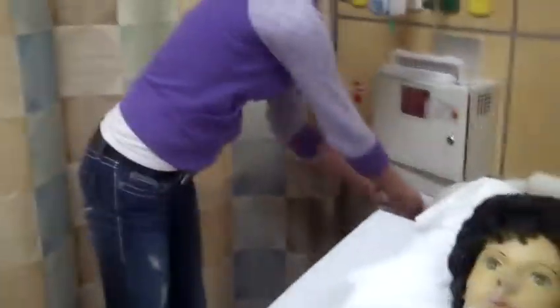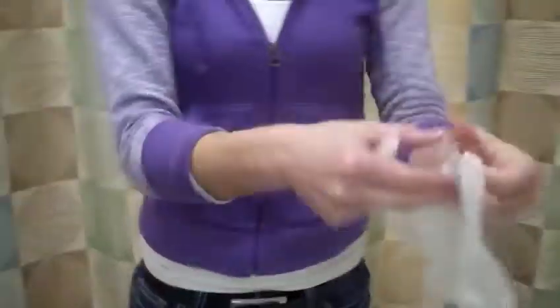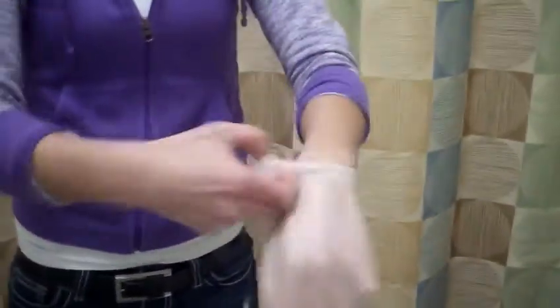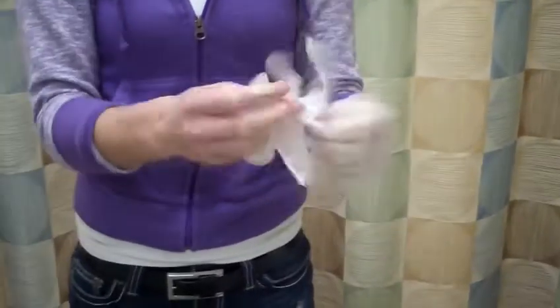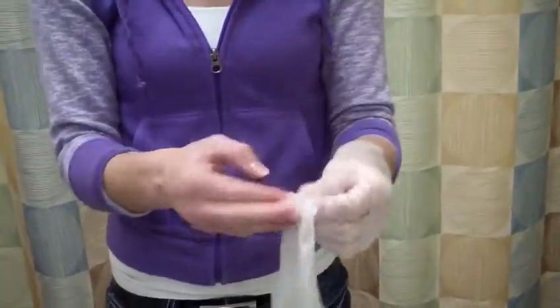I'm going to put on clean gloves. For some reason this thing just wants to flap back. And if needed, I would have someone assist me in putting her in the dorsal recumbent position.